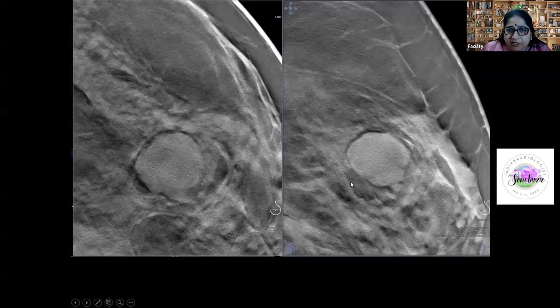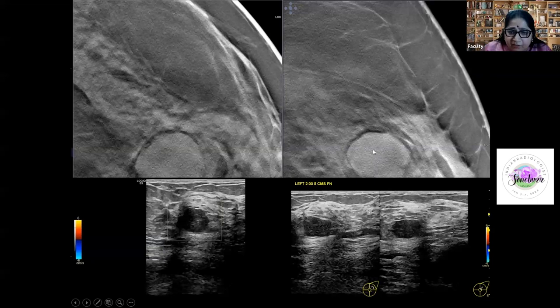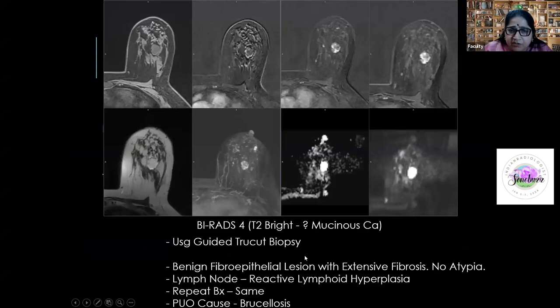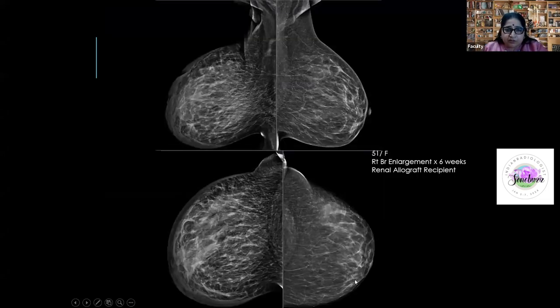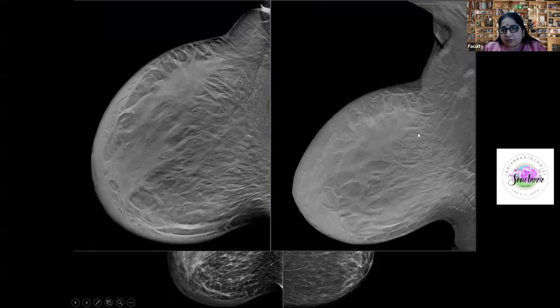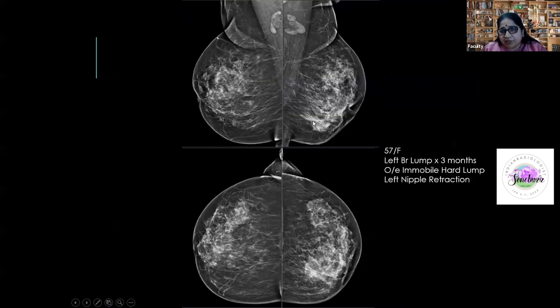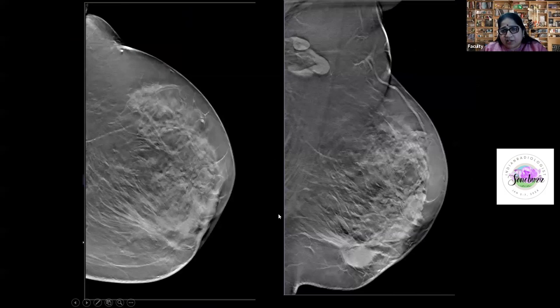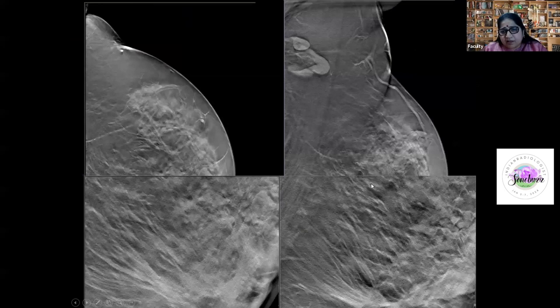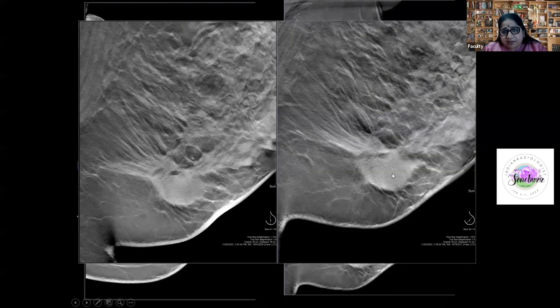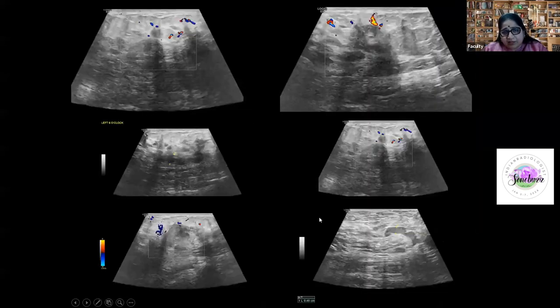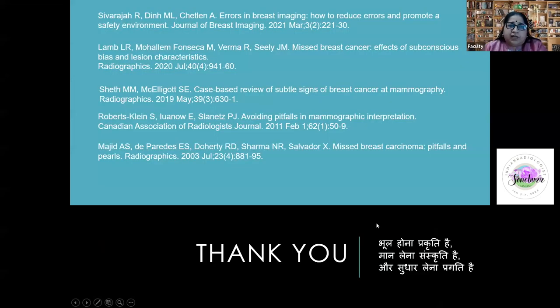False positives also occur. A mass with microlobulated margins found on CT for pyrexia of unknown origin was thought malignant by everyone. It was T2-bright — we suspected mucinous CA — but biopsy showed fibroadenoma. While awaiting a second biopsy, the PUO cause came out as brucellosis. Not all lymphedema is inflammatory cancer: one patient looked like inflammatory breast cancer but it was tuberculosis, resolving on ATT. Another spiculated mass called BI-RADS 4C was idiopathic granulomatous mastitis (IGM).